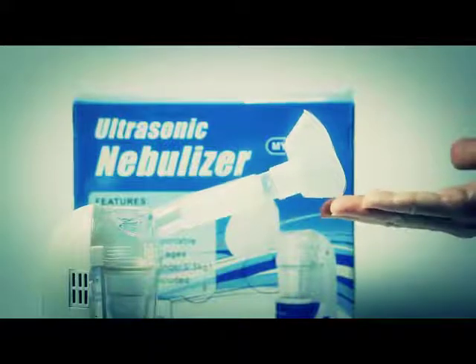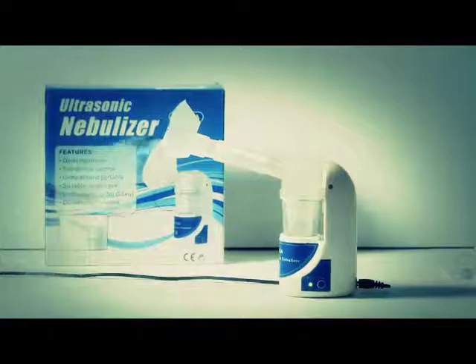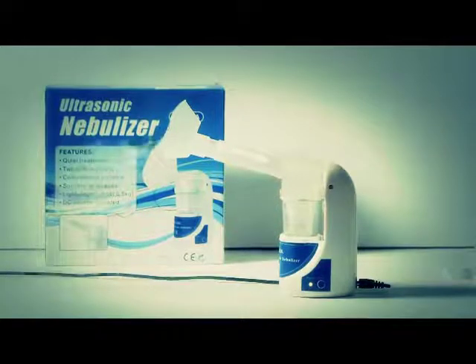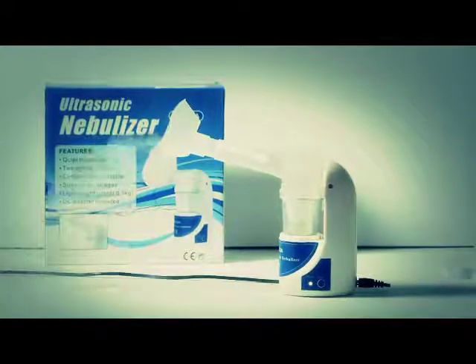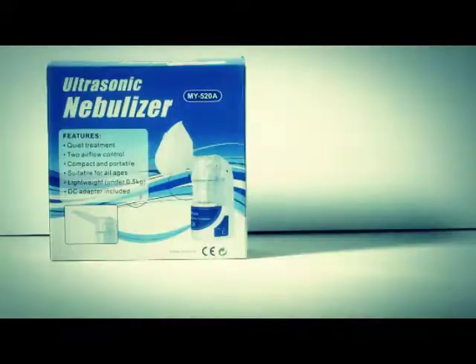This is the MY520A ultrasonic nebulizer. It's very quiet. It has a two airflow control system. It's lightweight, compact, and portable, and it has attachments for all ages and sizes.